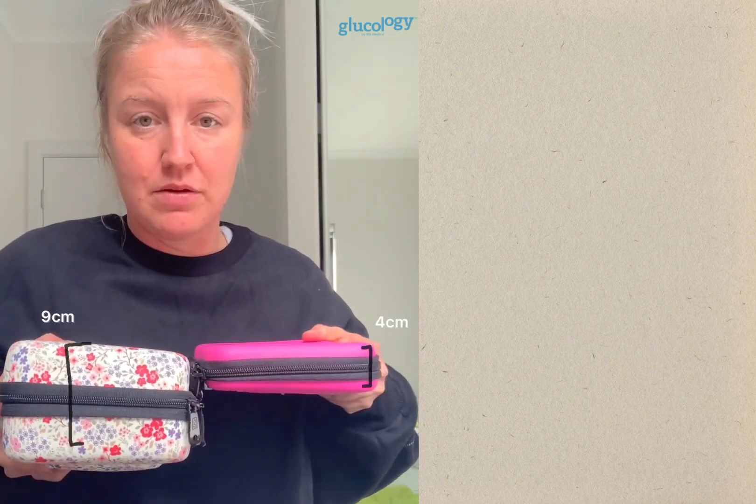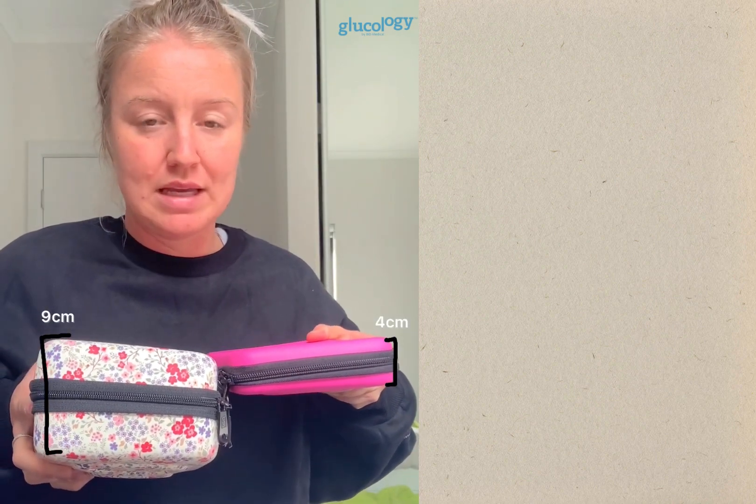In comparison, the travel case plus is far larger — more like the size of a lunchbox, though you can still put your hands around it. This is the case you'll want if you're traveling, even for an overnight situation, because you always want to have more than what you need just in case something happens.